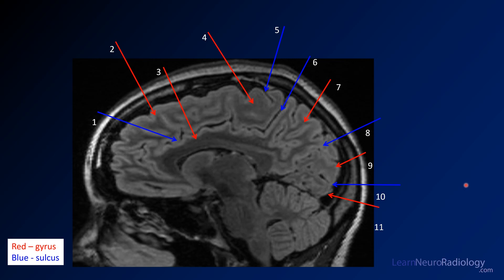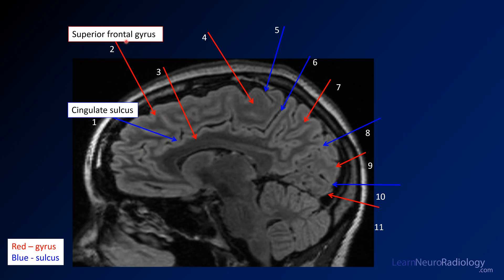Finally, I'm going to show you a midline image and we'll go through some of these structures. The blue are sulci and the red are gyri. Number one here is the cingulate sulcus. The gyrus adjacent to the midline in this part of the frontal lobe — number two — is the superior frontal gyrus, seen just a little bit off the midline. This arrow is referring to the gyrus just above the corpus callosum; if this is the cingulate sulcus, then that's going to be the cingulate gyrus.